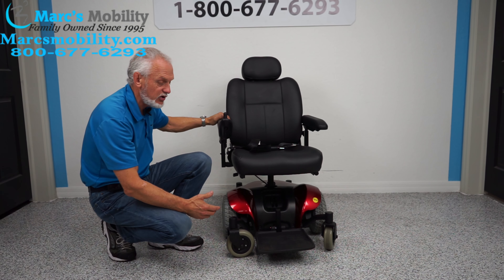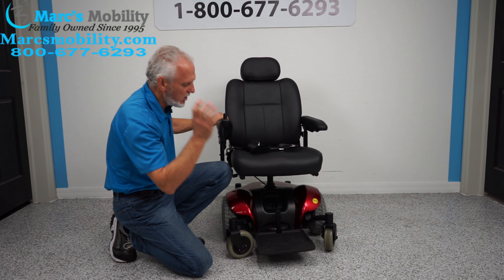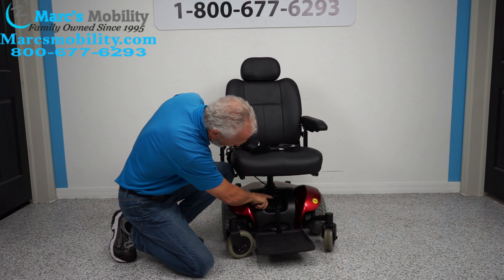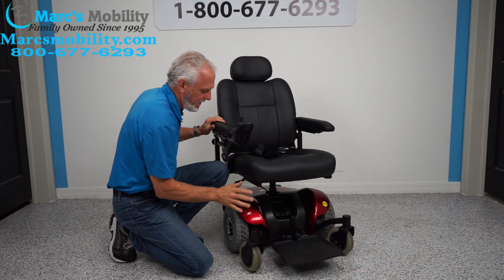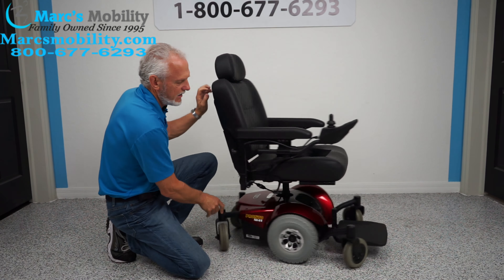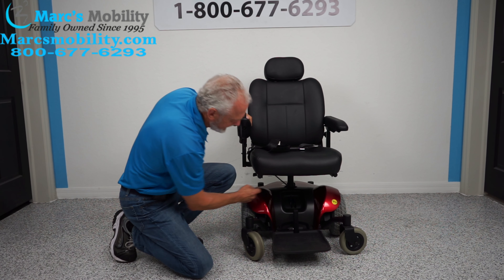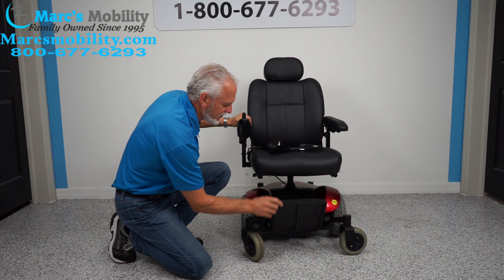If you ever need to put this chair in neutral — because if you want to roll it around you can see it's in gear — turn the power off. Right here you have two levers. One, two, and now you're in neutral. As you can see how easy that is. Put it back up when you're done.